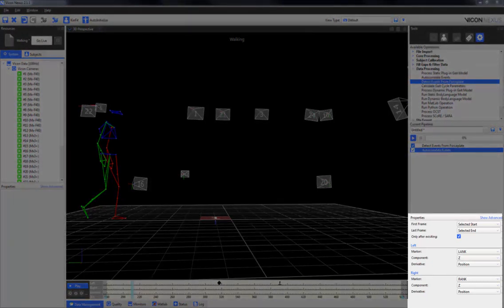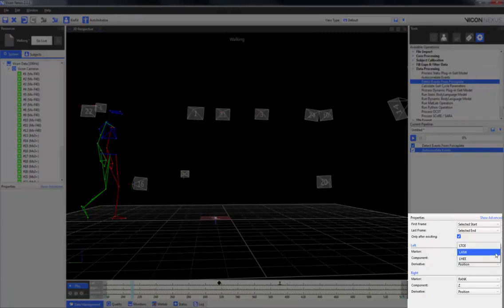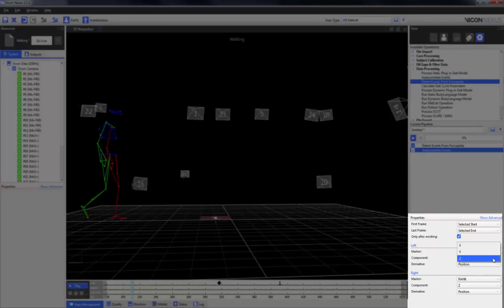You are able to alter the marker that is used. You can also select whether it is the X, Y, or Z component that you want to use. And finally, you can select whether the derivative is the position, the velocity, or the acceleration.